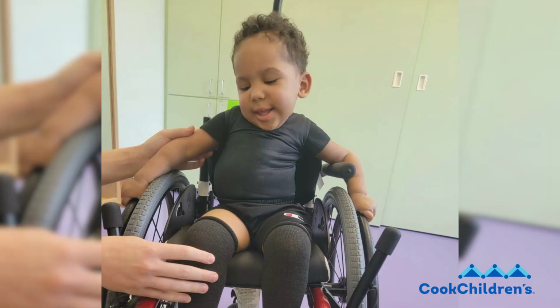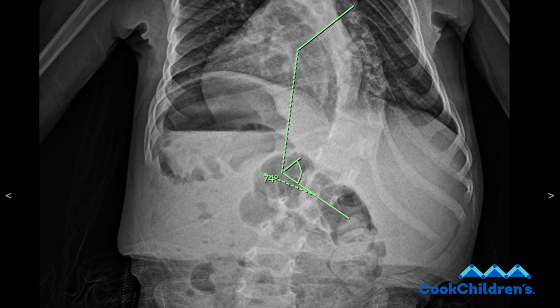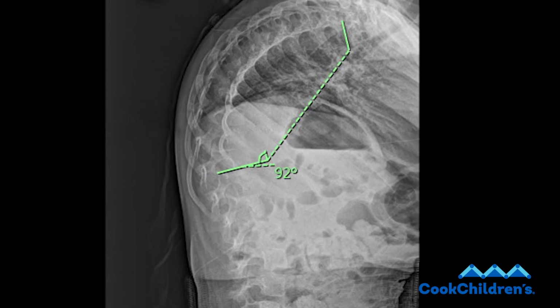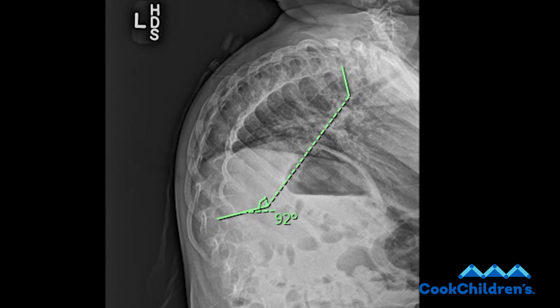So Rayden in particular has a diagnosis that makes his body weaker. And because of his weakness, he developed kyphoscoliosis, basically a big long word that means their spine is curved in pretty much every direction. I need to put in certain types of rods that are magnetic lengthening rods, and the middle of those rods are very, very straight. Rayden had all of these curves in his spine, and it was so curved that I couldn't just in one day go in and put those magnetic lengthening rods in. So he needed to have halo traction first so it could gradually stretch out his spine.